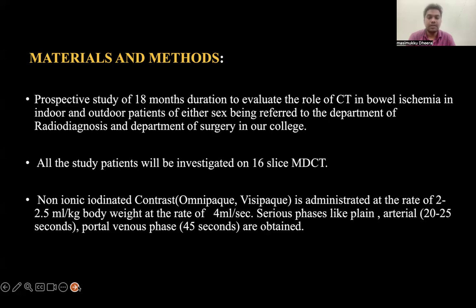Non-ionic iodinated contrast like Omnipaque, Visipaque is administered at the rate of 2 to 2.5 ml per kg body weight at the rate of 4 ml per second. Serial phases like plain, arterial, portal venous phase are obtained.